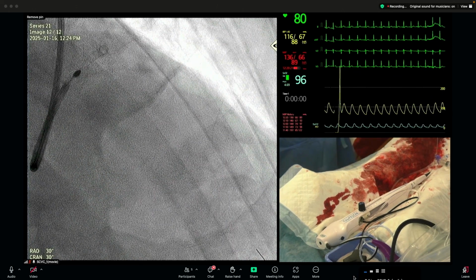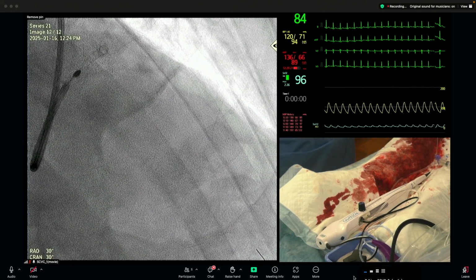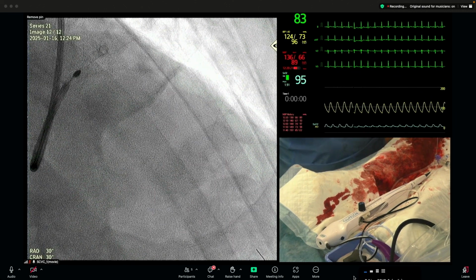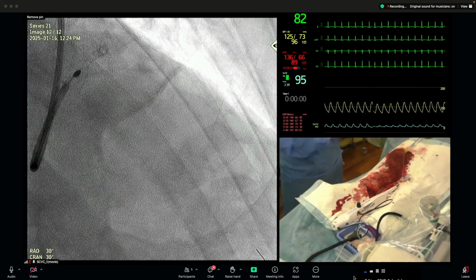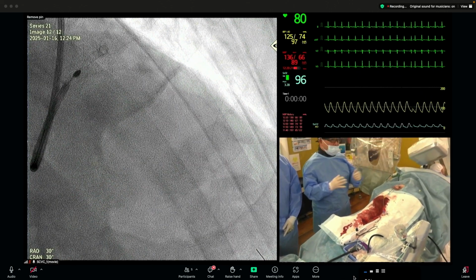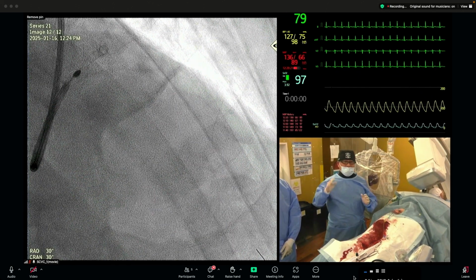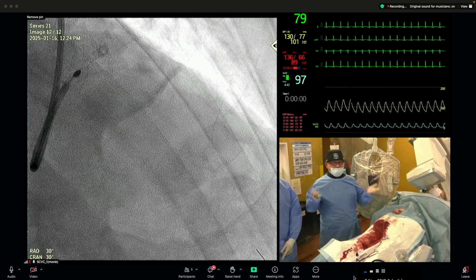Okay, Kwon-sensei, of course, I agree, as a part of your suggestion. Recently, our younger colleague, Yui-sensei, presented some data. Acute lumen gain is important in severely calcified regions, but with that alone, 1-year MACE increases, about 20% more.